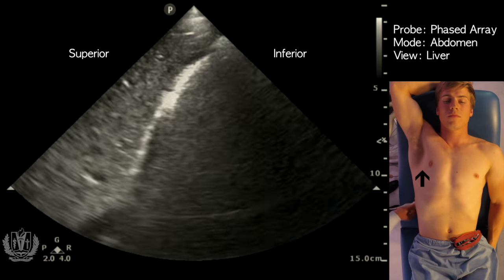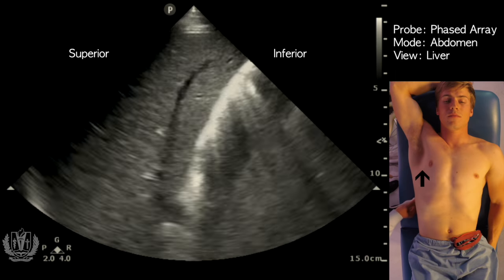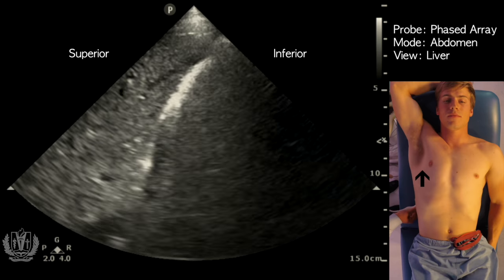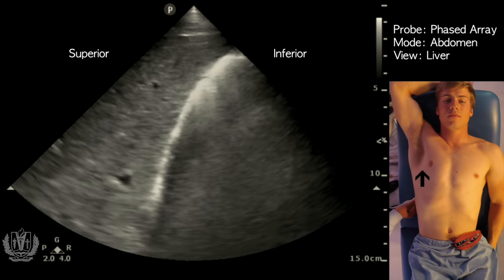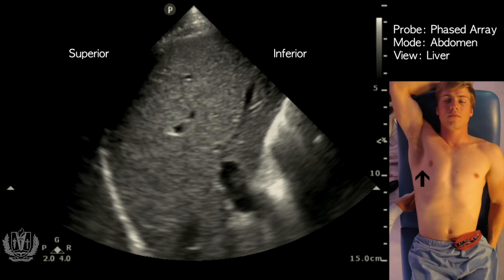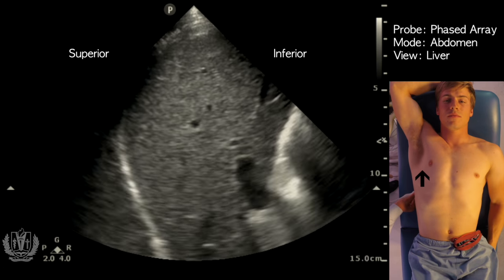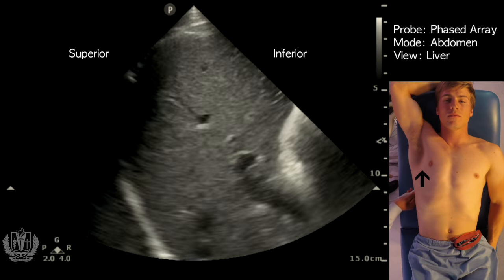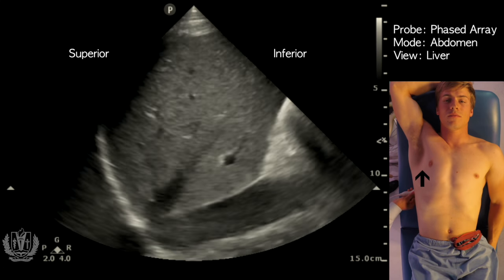This is also a great view to look for hepatomegaly, and you can measure that from the top of the diaphragm to the inferior edge of the liver. You can also assess the echogenicity of the liver — if it's bright, that's consistent with chronic scarring or cirrhosis; if it's very dark, that would indicate hepatitis due to fluid inside the liver from inflammation.